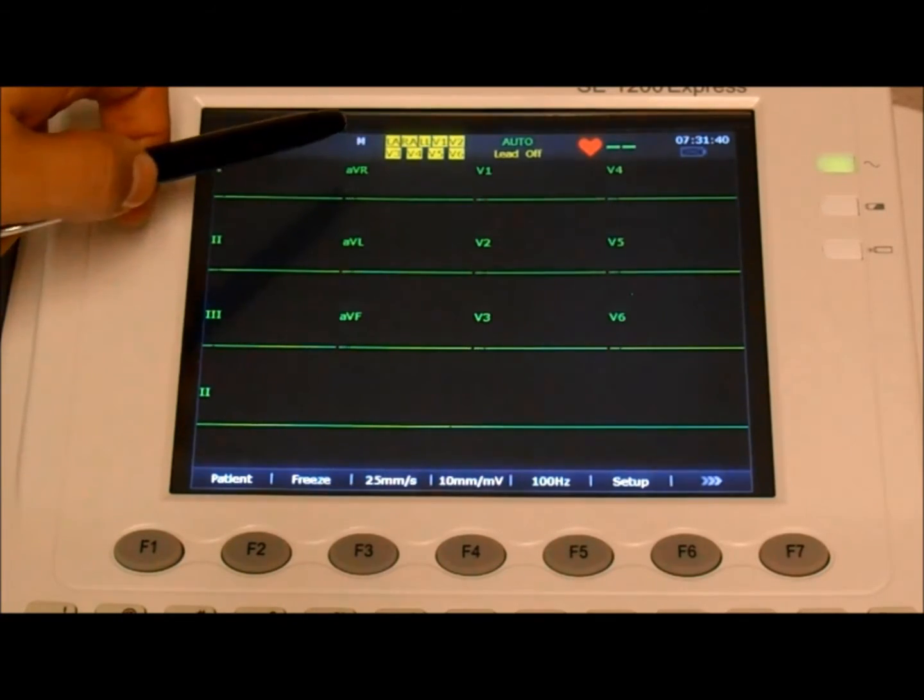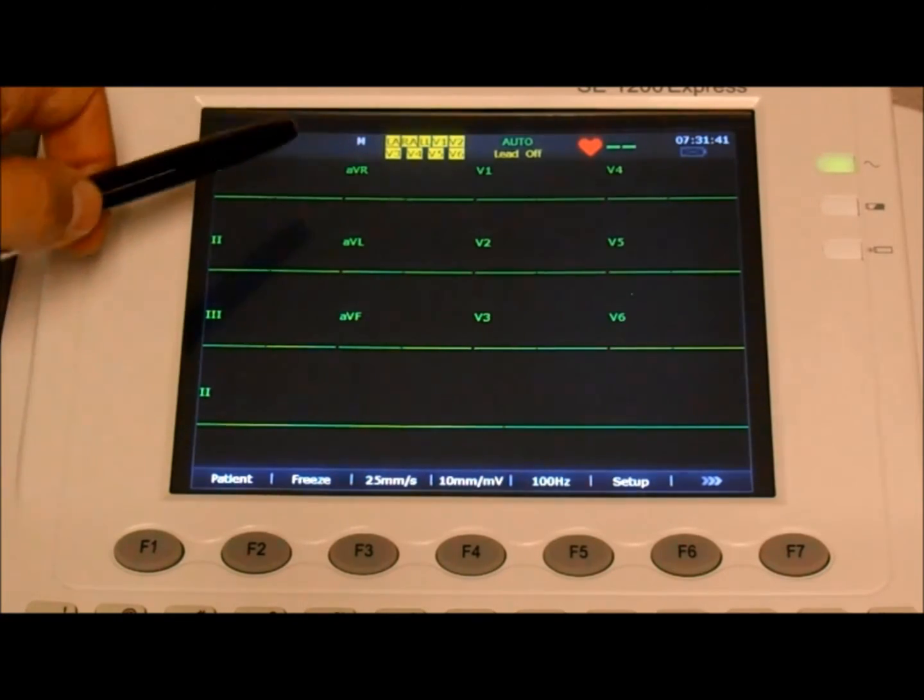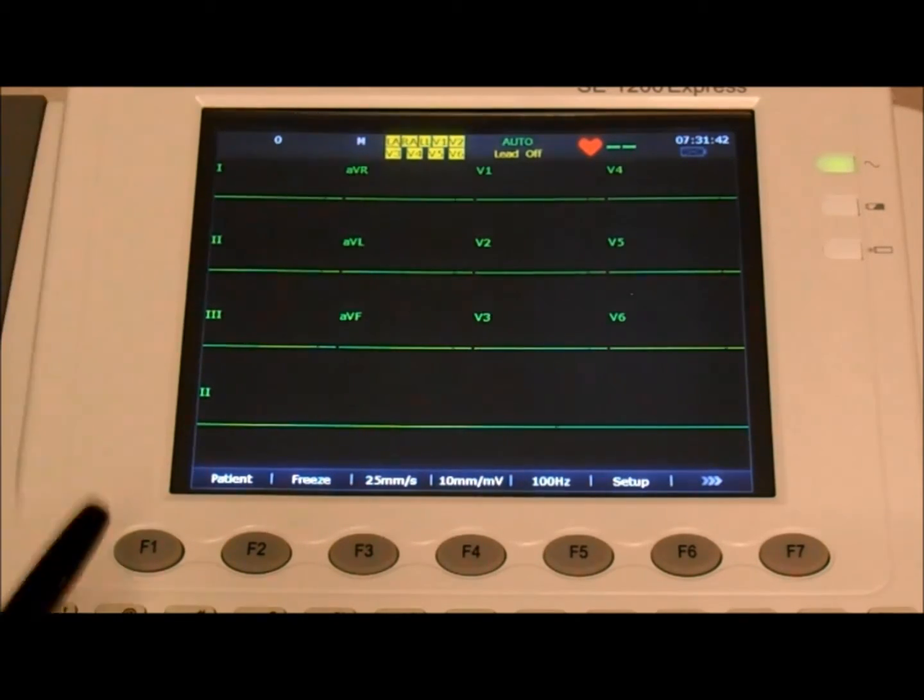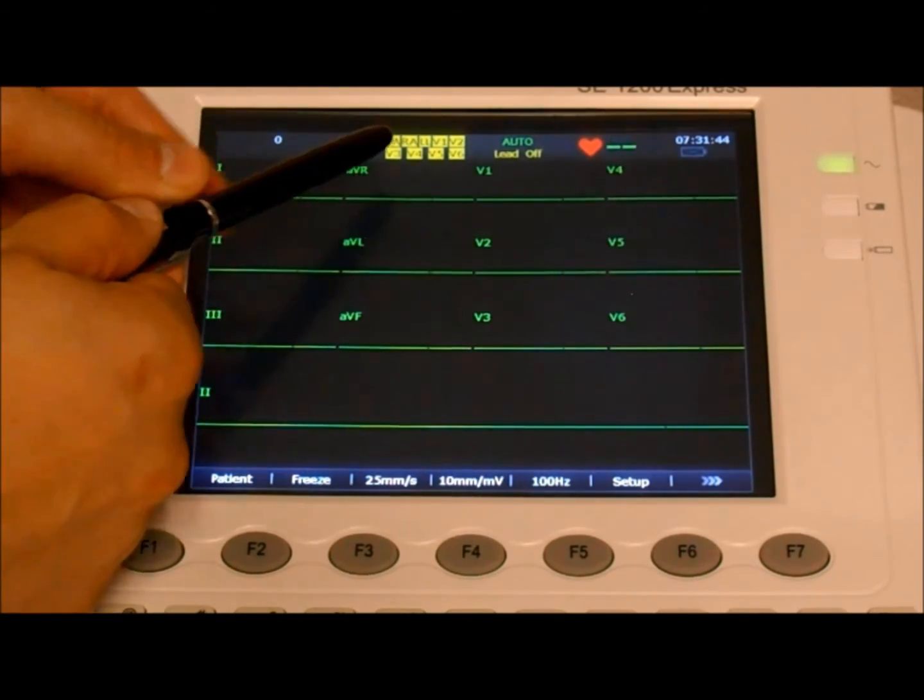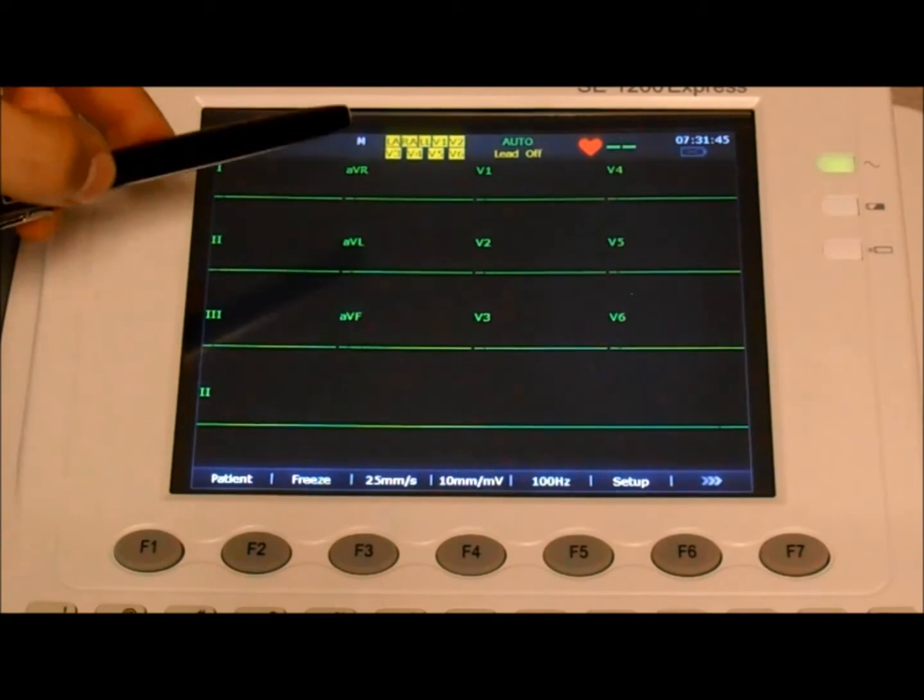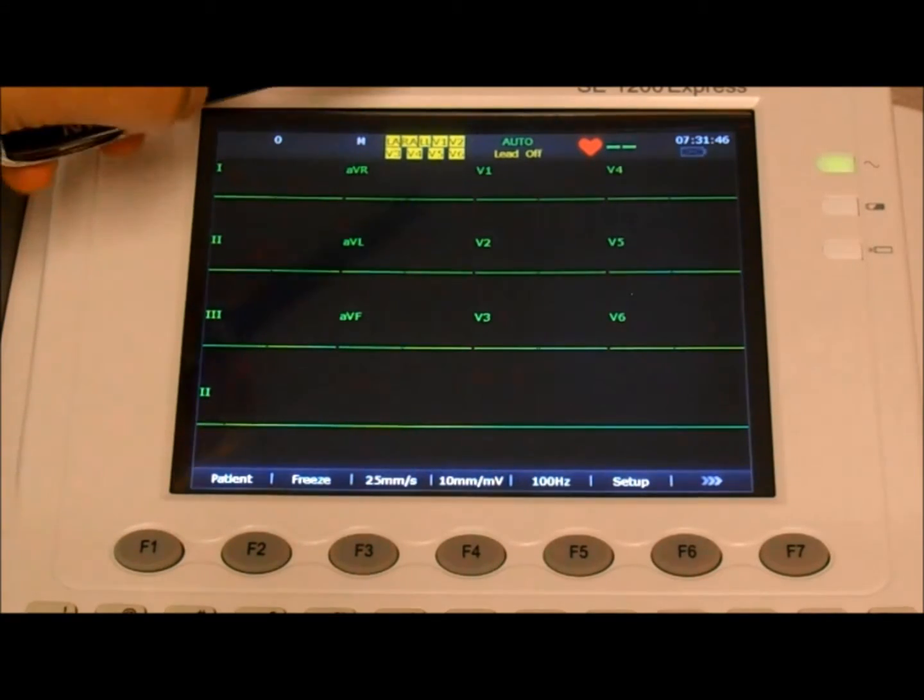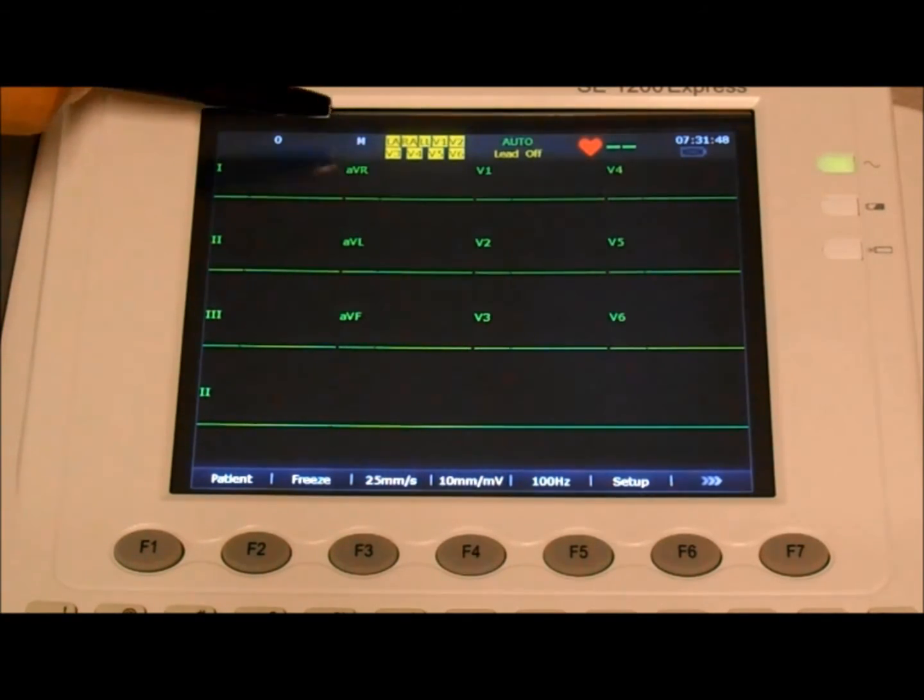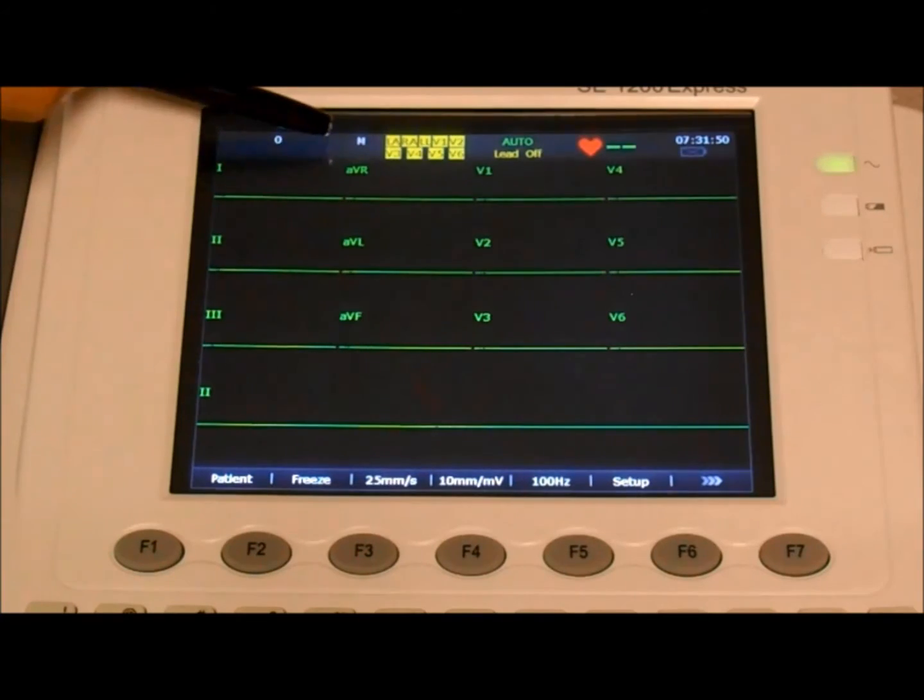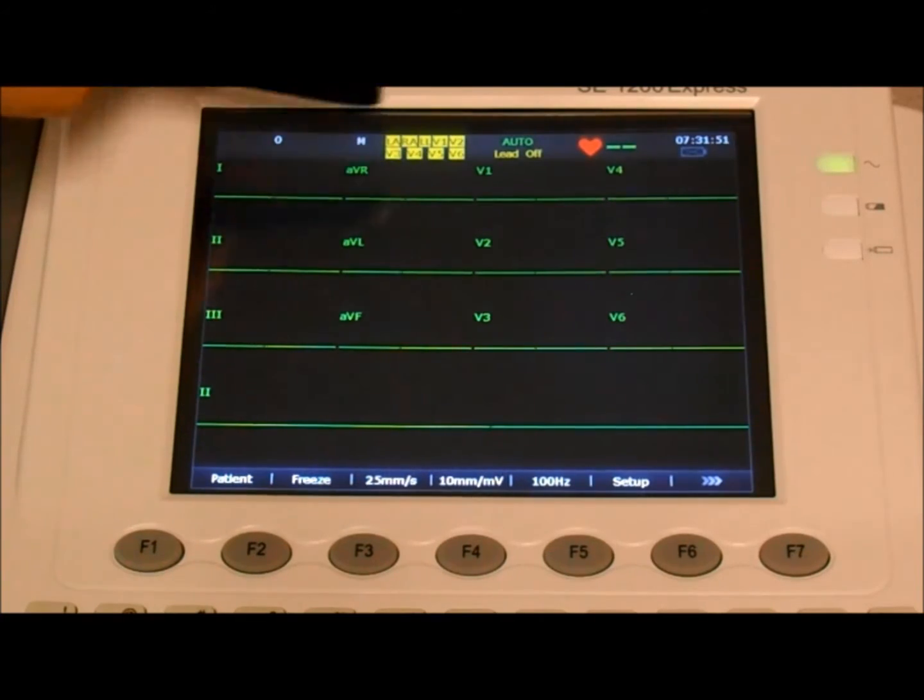The lead information box has the listing of all the different electrodes or points. If the electrodes are not properly connected, the designation is going to have a yellow background. So right now, the patient cable is not connected and all of the leads have a yellow background.